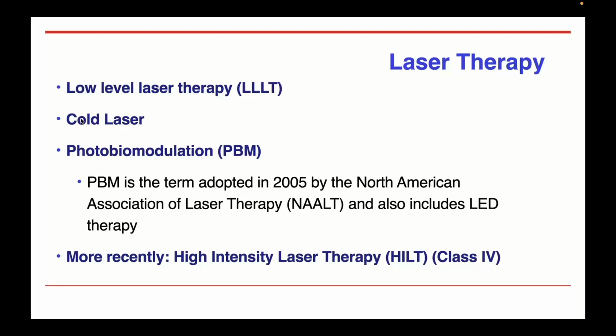The North American Association of Laser Therapy officially adopted the term photobiomodulation about 16 years ago, but photobiomodulation also includes LEDs. Laser light, as you know, is monochromatic, is collimated and coherent, and LEDs are also monochromatic but not coherent.